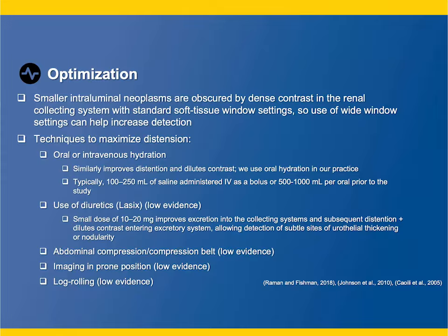When we do kidney studies, we typically use water as a contrast agent. We like to distend the bowel, the stomach. Also, you're hydrating the patient. We do not use positive contrast. We do not use diuretics.